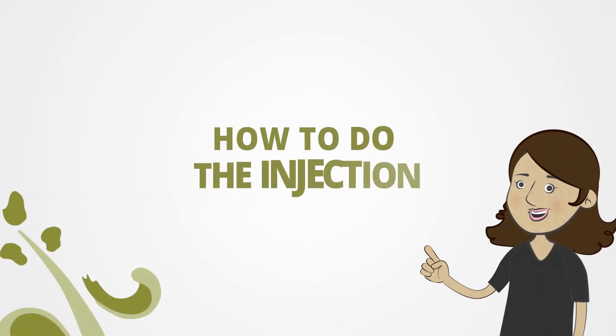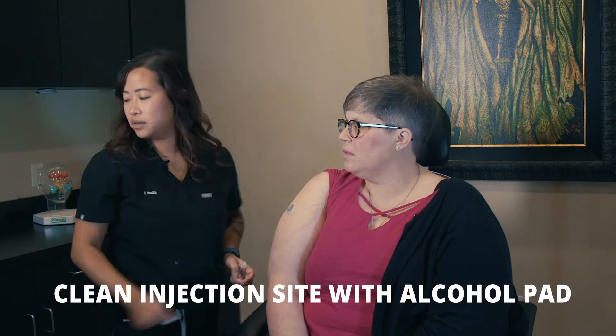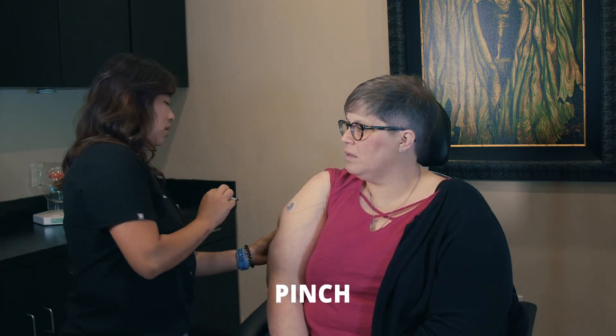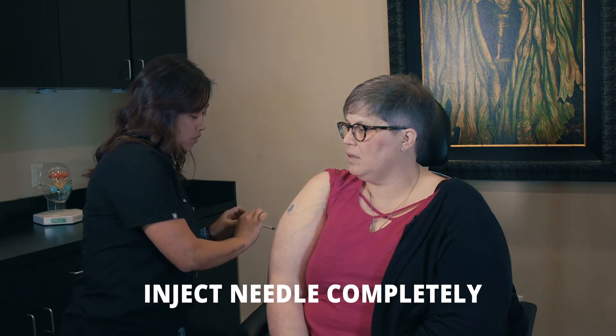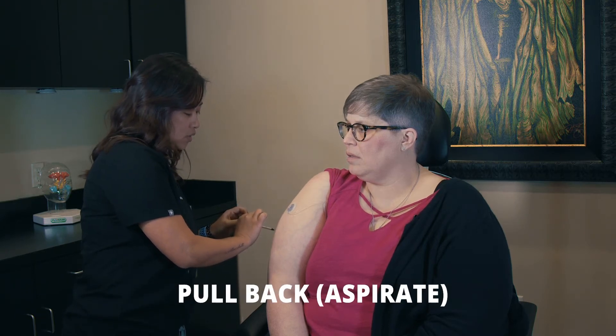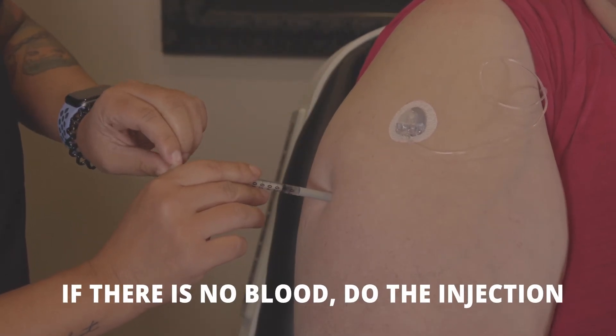Next, I will show you how to do the injection. We are going to clean the injection site with our alcohol pad. Then we are going to pinch. The needle is going to go all the way in, and then we're going to want to pull back or aspirate. If there is no blood, we'll go ahead and do the injection.